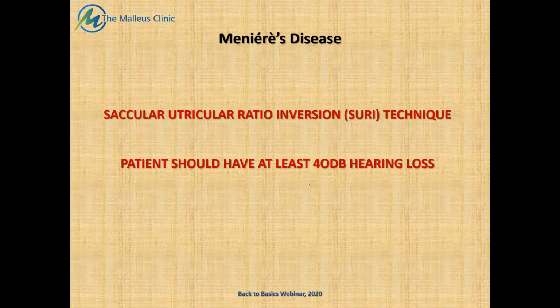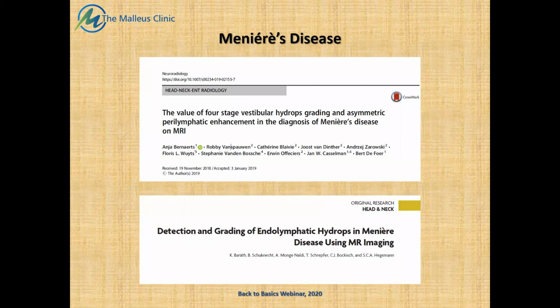Okay, so these are some of the other references that you have regarding the grading of Meniere's disease as far as their imaging is concerned.